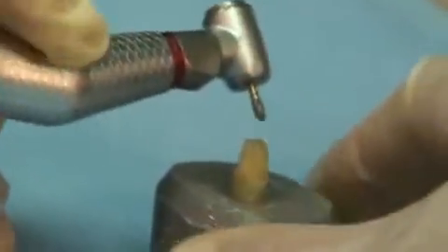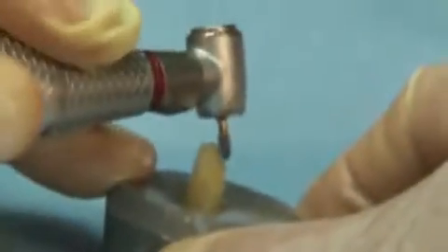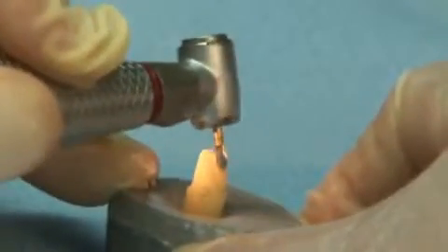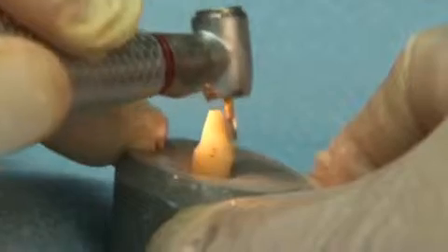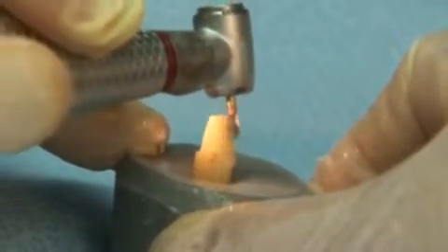Creating proper preparation form is often completed with the use of the football-shaped Great White Number 379-023 bur. The round elongated surface of this bur conforms to the natural concave lingual surface found in anterior teeth, as well as to the cusps, ridges, and grooves found in the occlusal surface of posterior teeth.